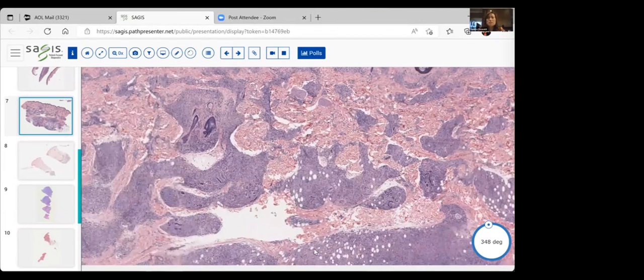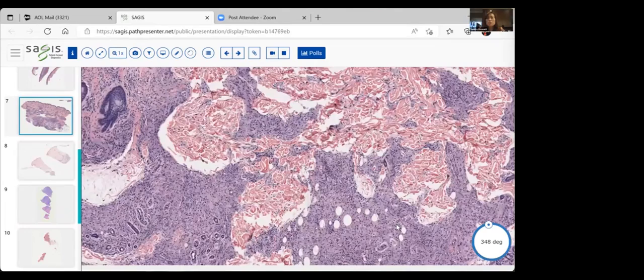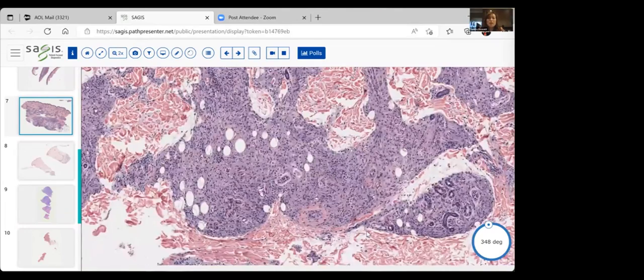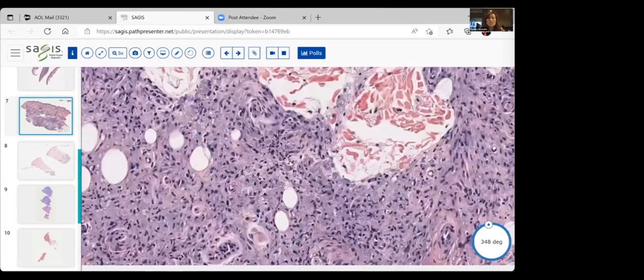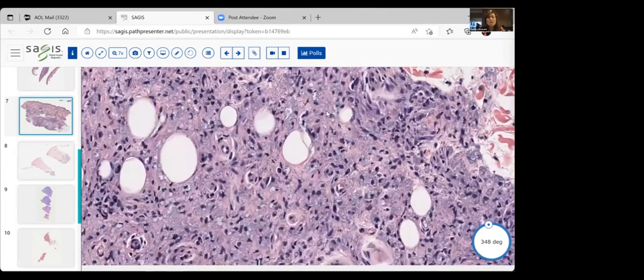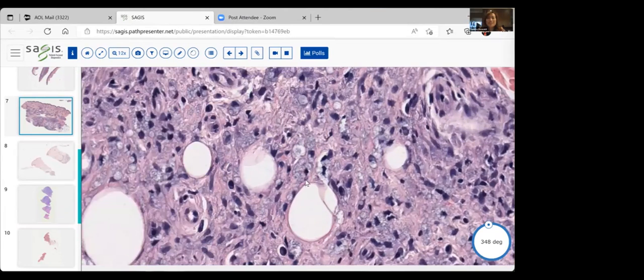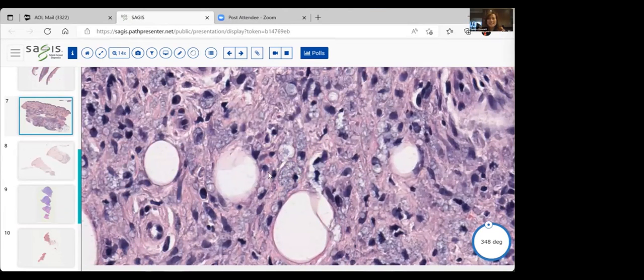And sometimes it is very difficult to see, and sometimes there's overlapping in features. So we're going to look a little closer at these histiocytes and see if they have what may be evidence or the suggestion that there may be bacteria within them. I'm going to go really close. I know in today's lecture we're going really close to these cells. This is a histiocyte, this is the nucleus, and you can see this blue-gray material. Does everybody see all this blue-gray material? Well, this blue-gray material is bacteria. This is a lot of bacteria.